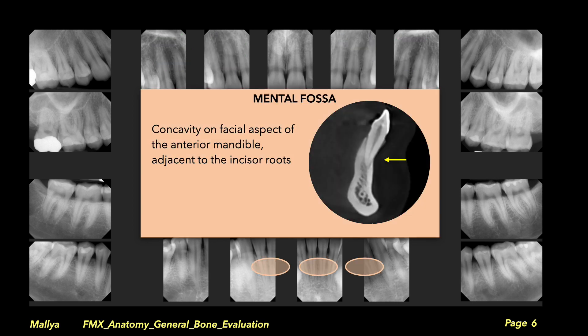A similar phenomenon also occurs in the mandibular anterior region. The buccal bone adjacent to the mandibular incisors is thin, and the mandible is relatively narrower in the region adjacent to the teeth. As a result, this area appears relatively radiolucent on periapical radiographs. Again, the lamina dura and periodontal ligament space surrounding the mandibular incisors is intact, helping you rule out apical periodontal inflammation and establish that this is an anatomic radiolucency.